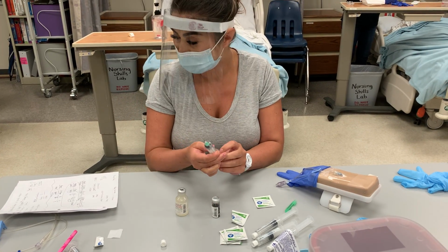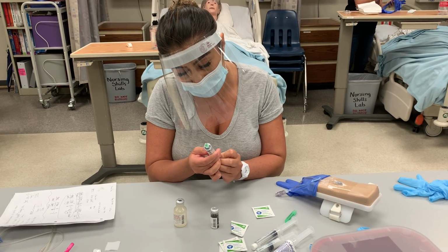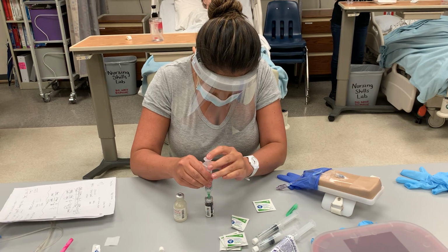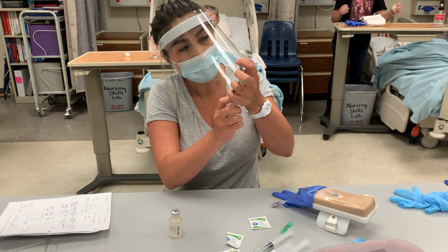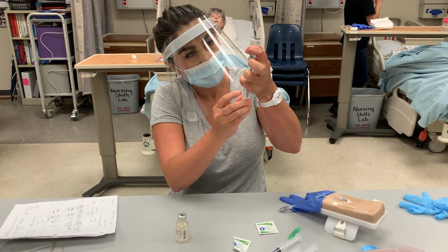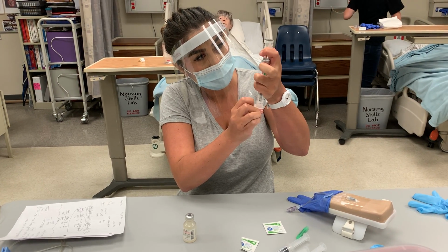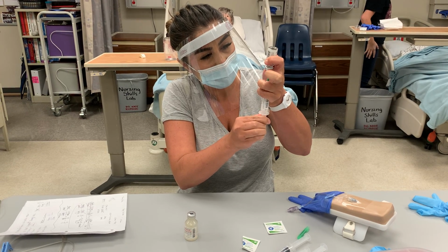Then for my medication, it's 0.8 mLs, so that's how much air I'm going to draw up. Okay, now I'm going to take my medication. I need to draw up 0.8 mLs of this.